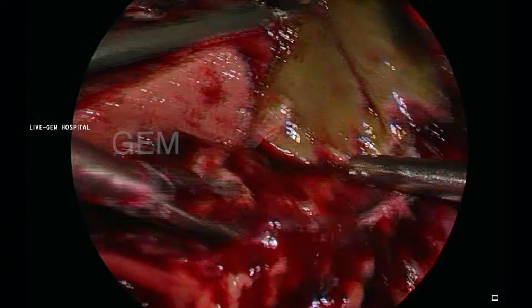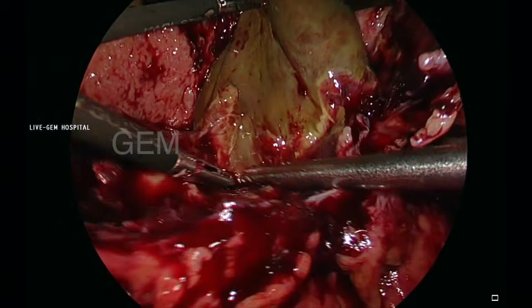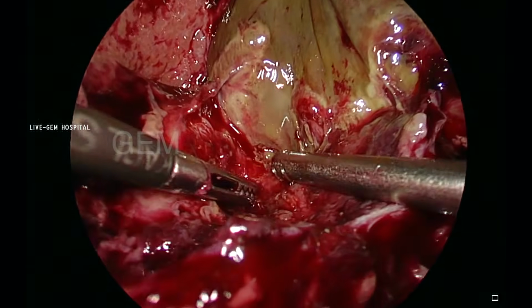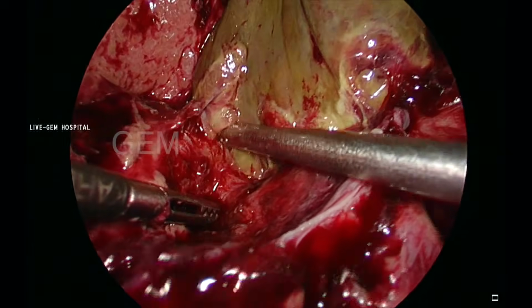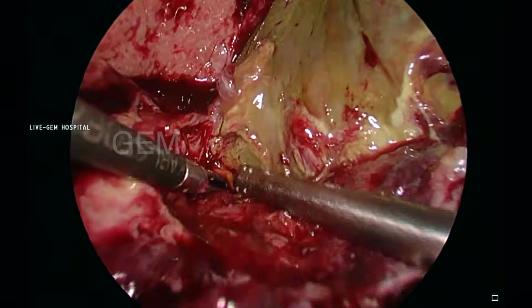Because of the acute inflammation, a lot of oozing is there, and all the blood will absorb the light. So you will see the image is not very bright. That is a disadvantage of these high definition cameras. If it is 4K, this problem will not be there.